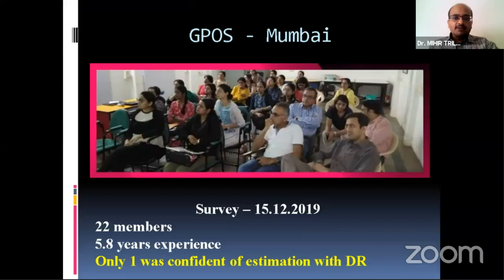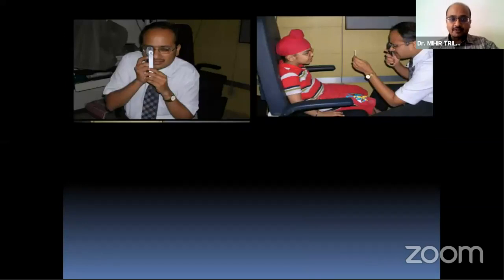In our survey of a group of pediatric eye surgeons of Mumbai, we realized out of 22 members having an average experience of 5.8 years in practice, only one pediatric eye surgeon was confident enough with the estimation of accommodation using MEM method of dynamic retinoscopy.